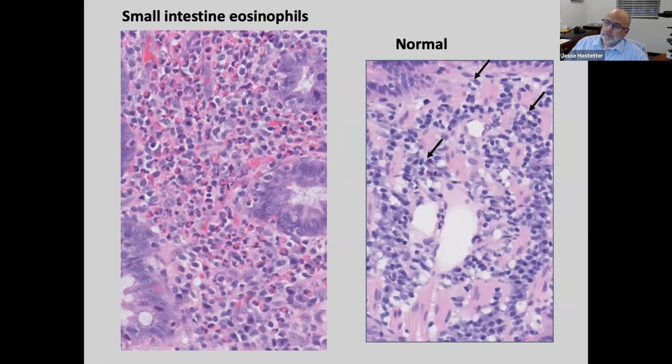Eosinophils, as I said earlier, or I'm sorry, this morning, they're there, and I think a couple things. One is don't mistake them for neutrophils, and it's easy to do that. The granules, the eosinophilic granules, don't always show through, especially in dogs. If you look at the screen long enough, you'll start seeing, and it's nice because there's arrows there, but there are a few eosinophils in here, probably 5 or 6 if we counted, and that's normal. If we compare that to the other end of the spectrum on this side of the screen, where we see a really severe infiltrate of eosinophils, I think all of us would be able to pick that up pretty quickly.